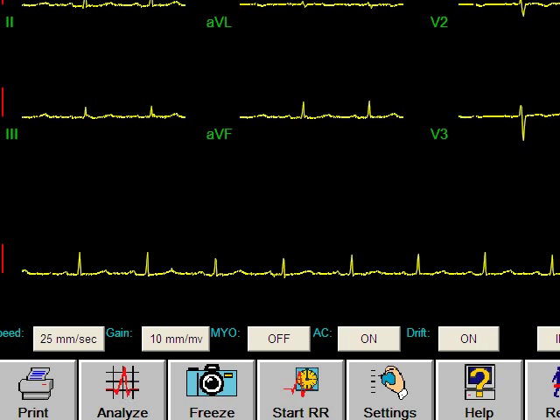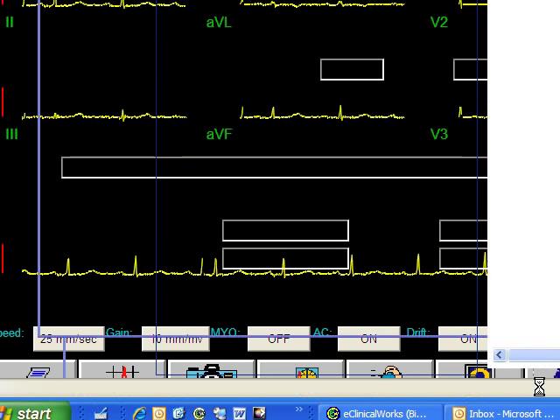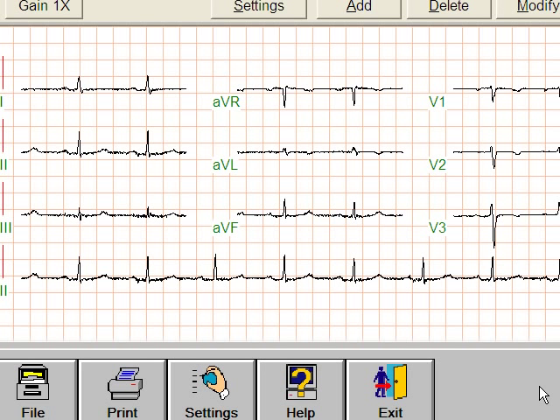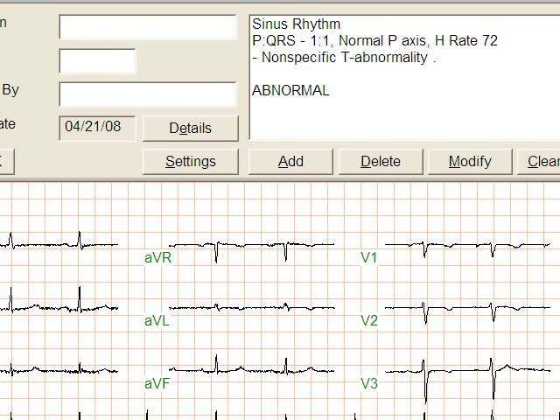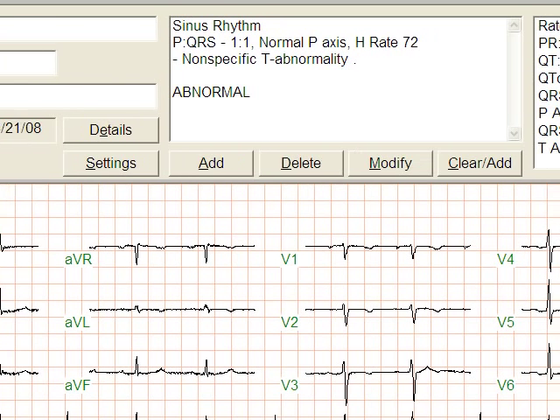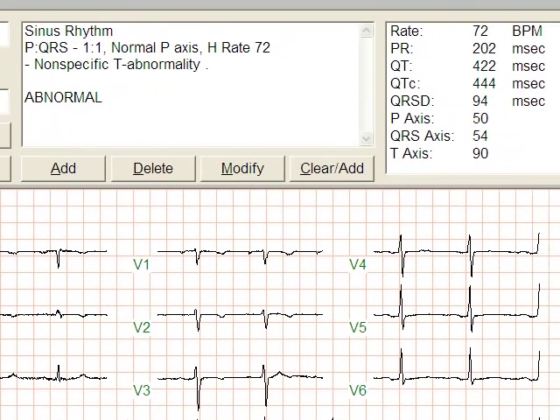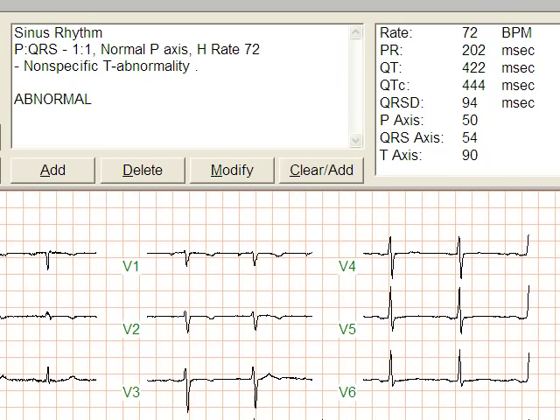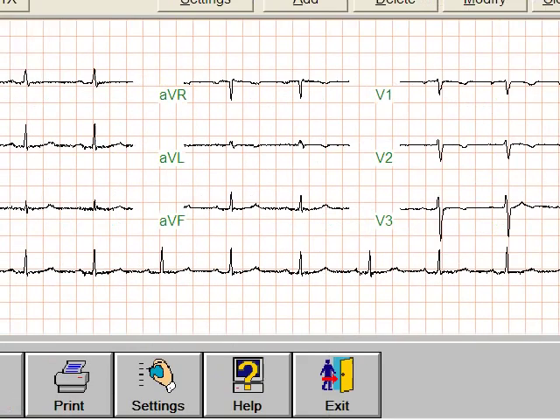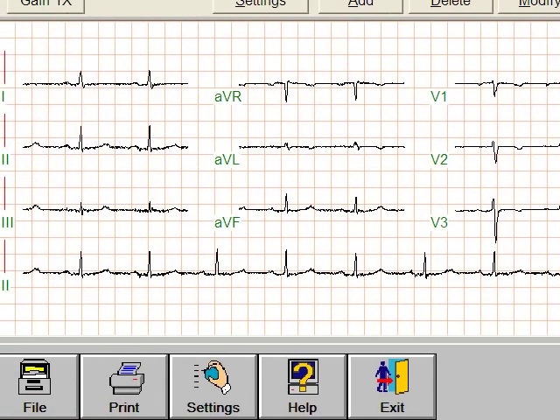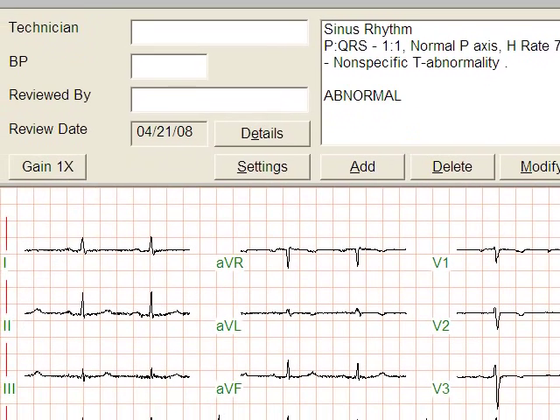It takes a second, does the analysis and pops up with the EKG in a traditional 12-lead format with a rhythm strip at the bottom. There's an interpretation at the top.